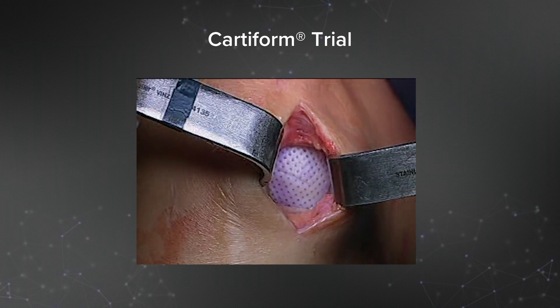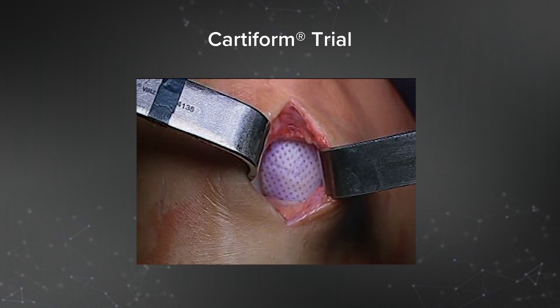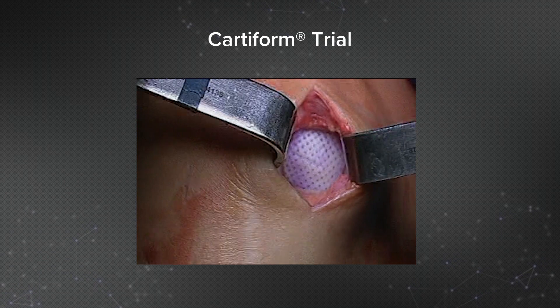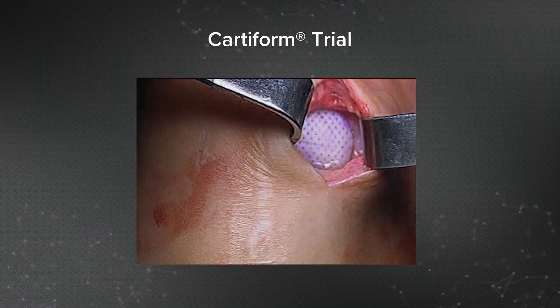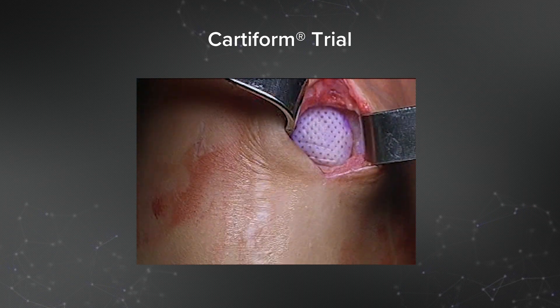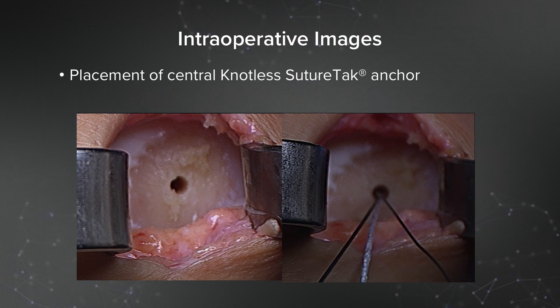Here's a video of the trialing. You can see me slightly extending and flexing the knee — this is a good match of the Cardiform to the lesion. Here's an intraoperative image of placing the Cardiform. First, you place a central knotless suture tack after drilling the pilot hole. I choose a knotless suture tack because it allows me to weave the suture in the central portion of the Cardiform and then reduce it down to the lesion without any prominent knots.